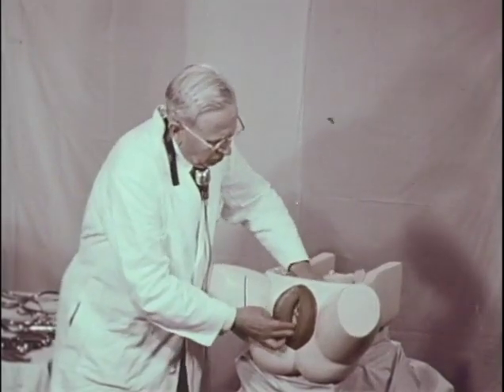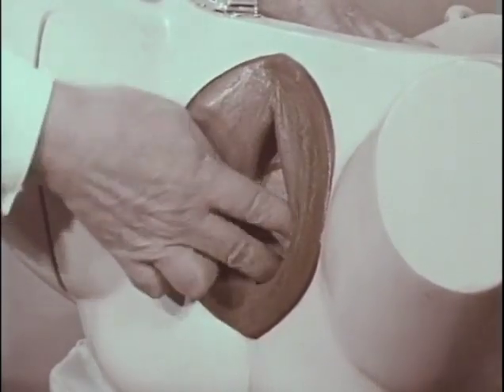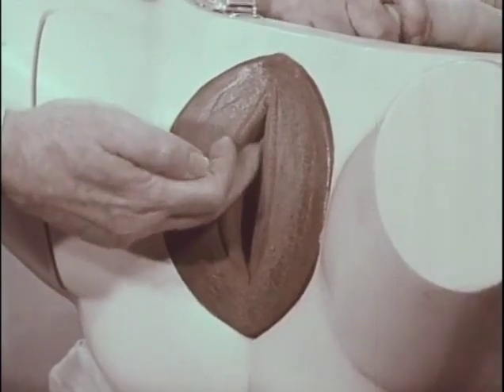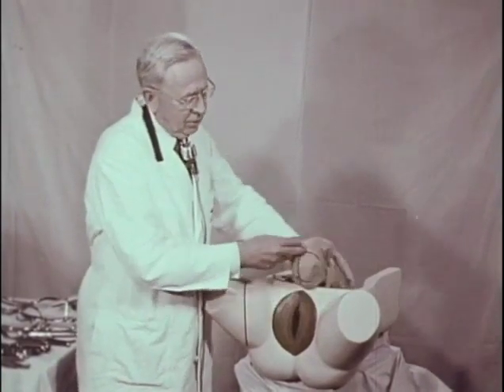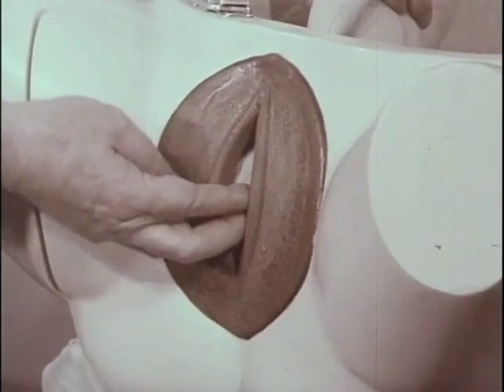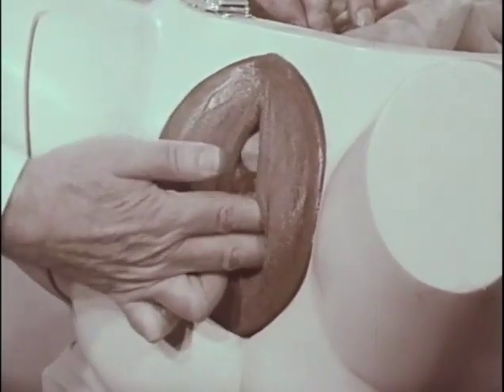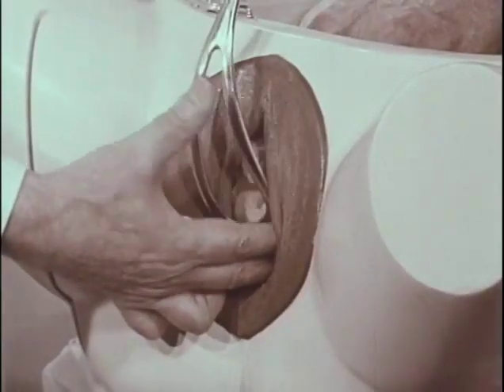In the manual maneuver for rotation of an occiput posterior, first is the digital maneuver, and it's carried out in a similar manner as that for the transverse arrest, except it's necessary to rotate the head over a longer arc from occiput posterior to anterior, an arc of 135 degrees to anterior, instead of from the transverse of only 90 degrees. And the same procedure is carried out, hooking, elevating, rotating around to anterior, and the fingers slip in behind the posterior parietal bone, holding it in place. While the posterior left blade is inserted.